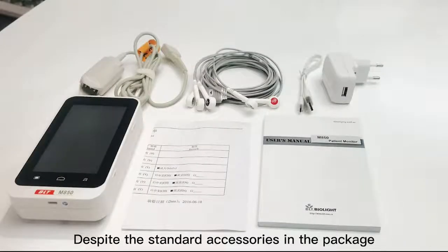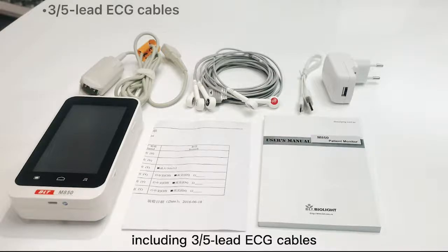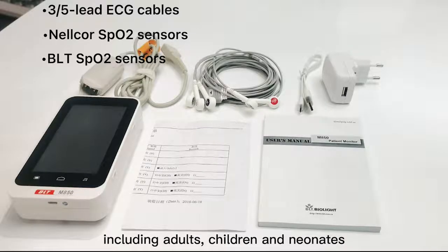Despite the standard accessories in the package, we also provide a series of optional accessories, including 3 or 5 lead ECG cables, Nellcor SPO2 sensors, and BioLite SPO2 sensors for people of different age groups, including adults, children, and neonates.